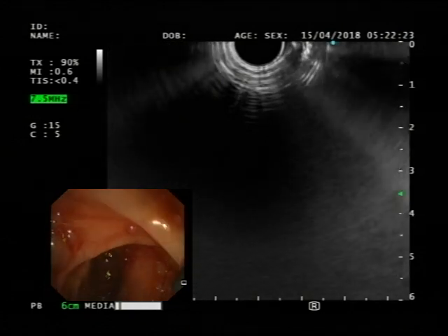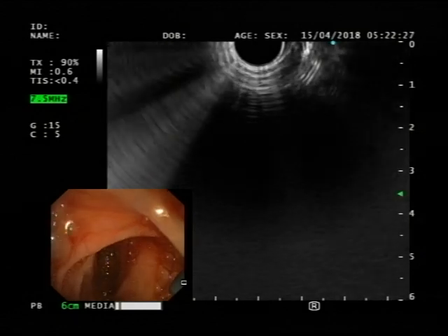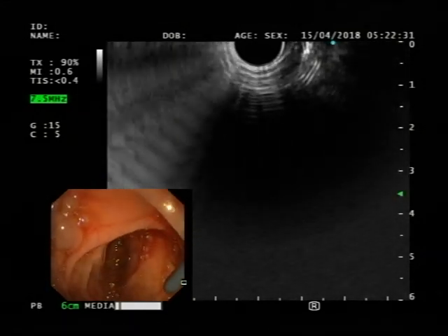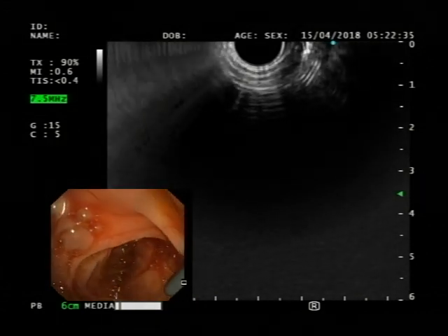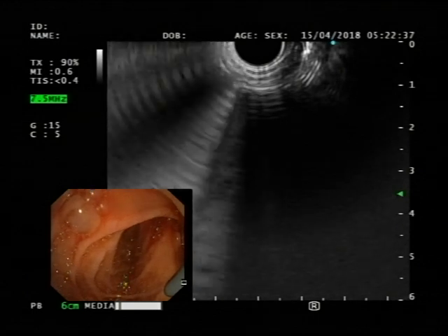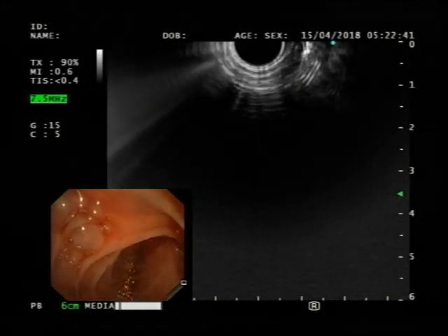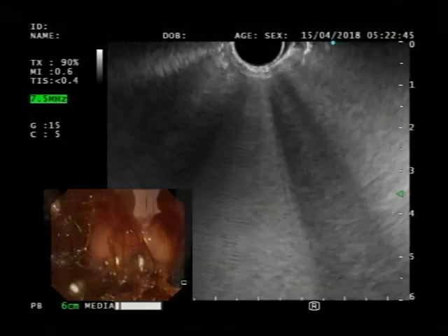So the other way to figure out how much needle to advance is to look endoscopically. You can see with my elevator movement how far my tip is. What happens in these duodenal positions is that sometimes the needle gets stuck because you're in a bend. And then when you advance it, it suddenly shoots forward. So you just want to make sure that it's a nice stable position, not too far out endoscopically, about this much. And then you can lock your stylet.